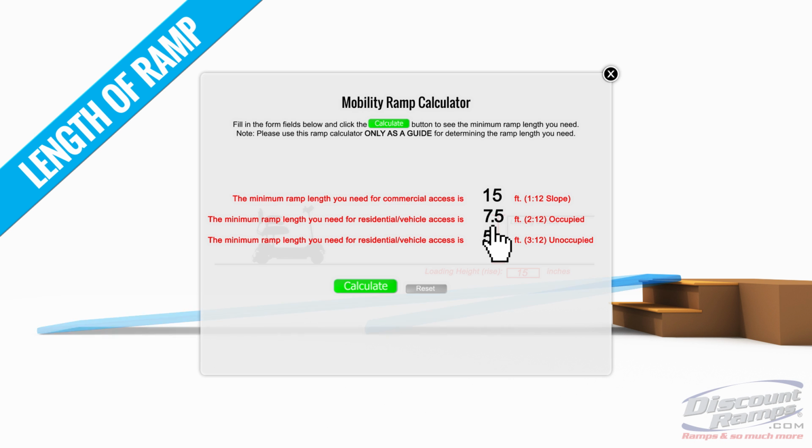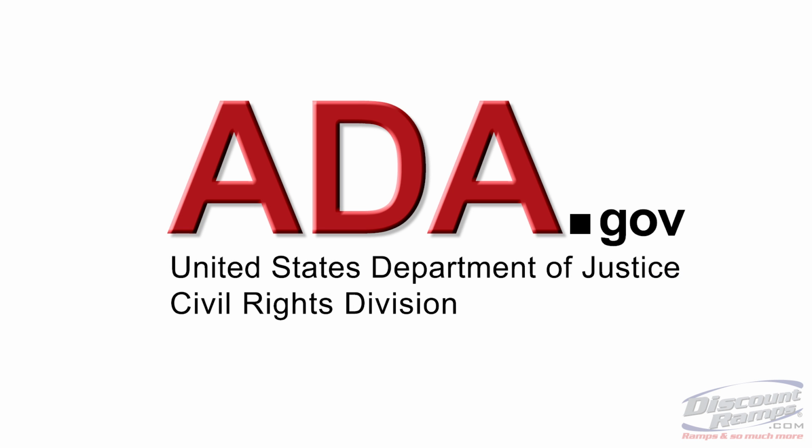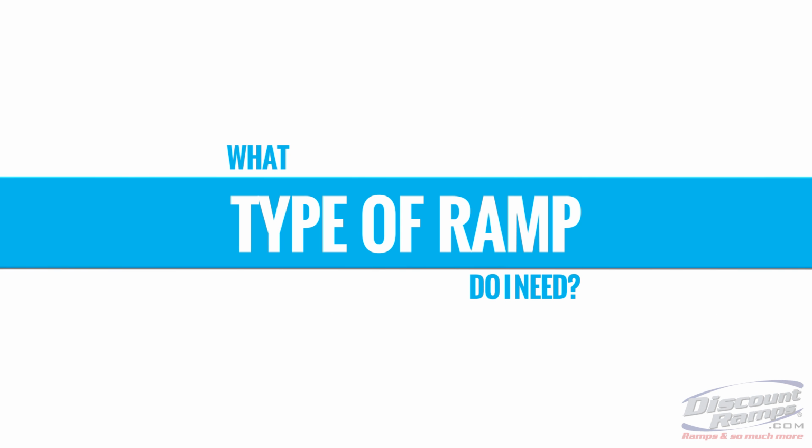The second number is the recommended length for residential or vehicle access of occupied wheelchairs or scooters. The last number is also for residential or vehicle access, but for unoccupied wheelchairs or scooters. These numbers follow the Americans with Disabilities Act guidelines. You can find out more about these guidelines at www.ada.gov.